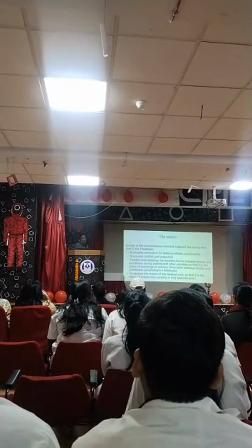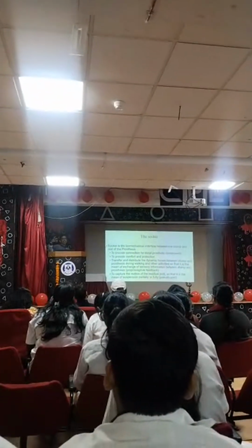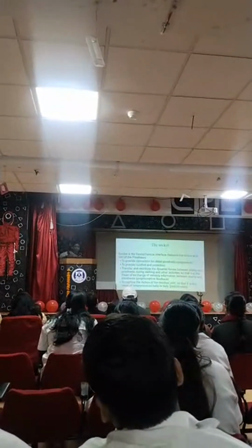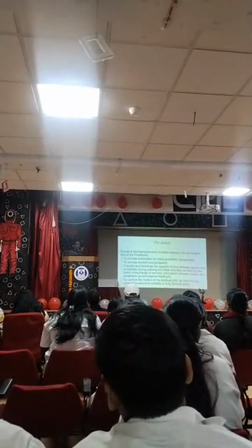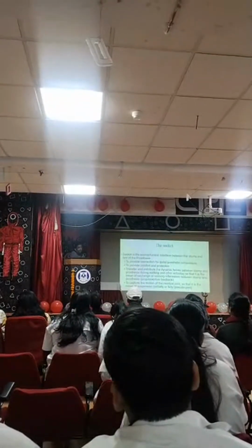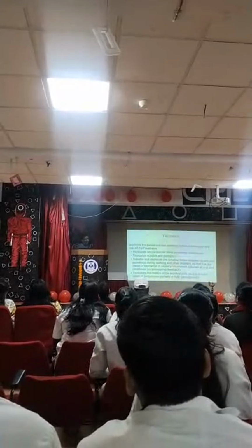And therefore we call it a new kind of proprioceptive feedback provided by the socket. Because in general we know our main load is being borne by the plantar surface of the heel, the plantar surface. Because of amputation that has gone. Now our stump has to become ready for taking load, and therefore a new type of proprioceptive feedback needs to be given, and that needs to be comfortable as well as protective. It should not be causing any injury or complication, and therefore the socket.